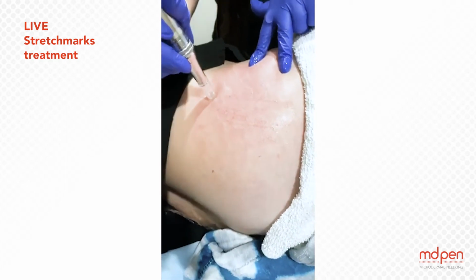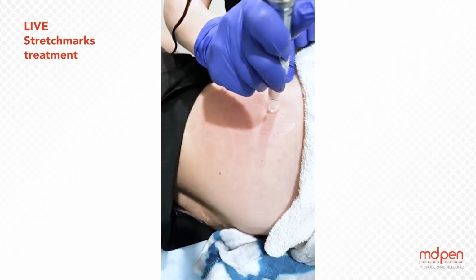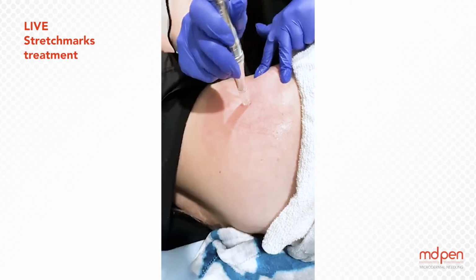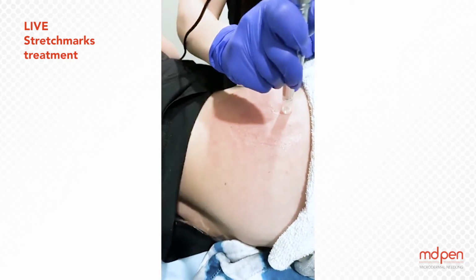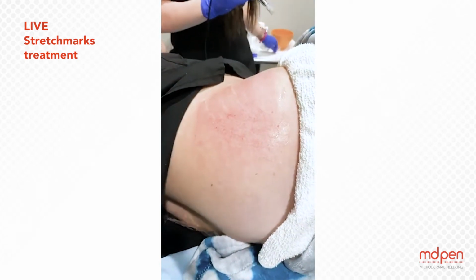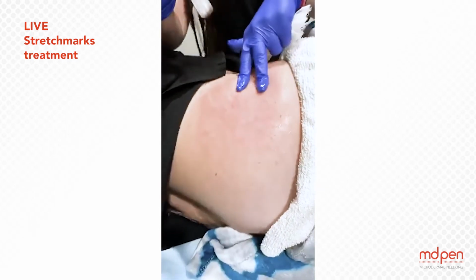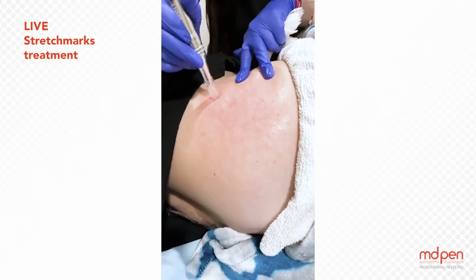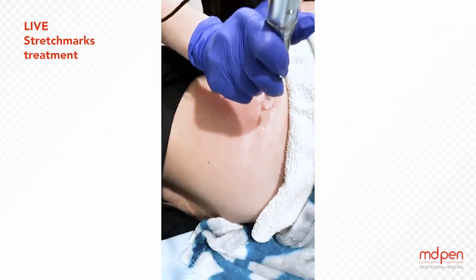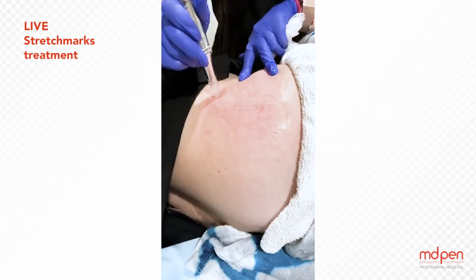Can you restate how long you need to wait in between treatments? Yeah, so the body is going to heal very well. You basically can work with 30 days just as you would a face. Sometimes skin types 4 and higher can have more post-inflammatory hyperpigmentation. So I would definitely let them know that. They could end up having a brown square on them for quite a few weeks following treatment. This is a treatment they could push out to 6 weeks if they can't make it right at 4 weeks. But if you're looking at 8 treatments, the best thing you can do is just try to stay on top of things.